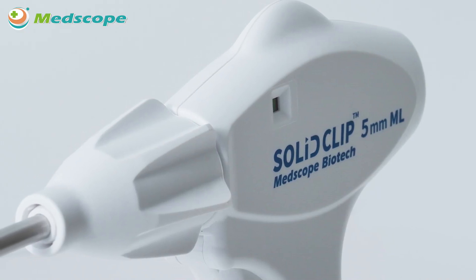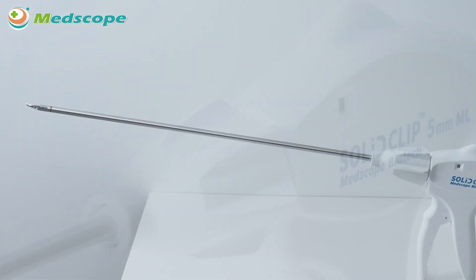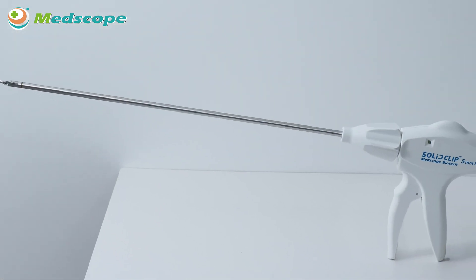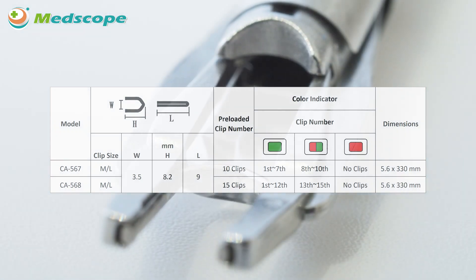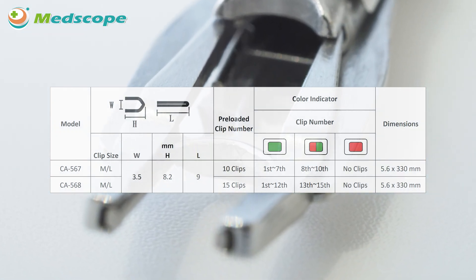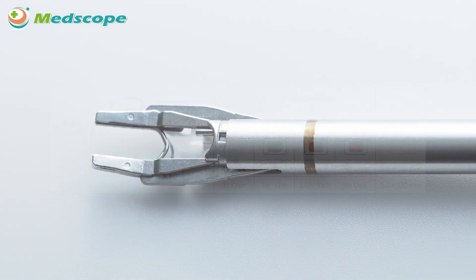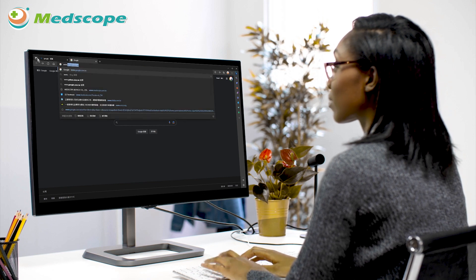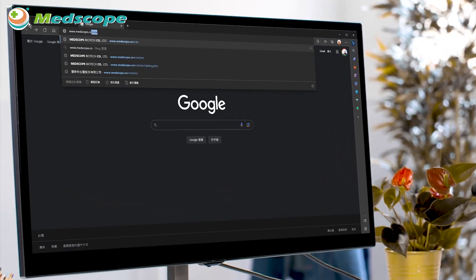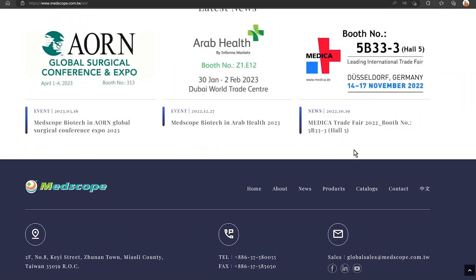A safety interlock will be activated to prevent the handle and trigger from being squeezed. This is the demonstration of the 5mm single-use clip applier CA56 series. Currently, the medium-large clip size model is available. The product contains 10 or 15 pieces of titanium clips. For further information and product specifications, please refer to the IFU or download the e-catalogue from our website at www.medscope.com.tw.